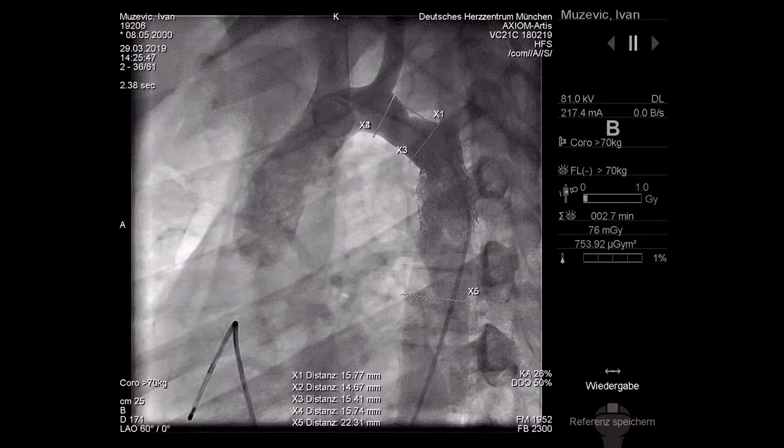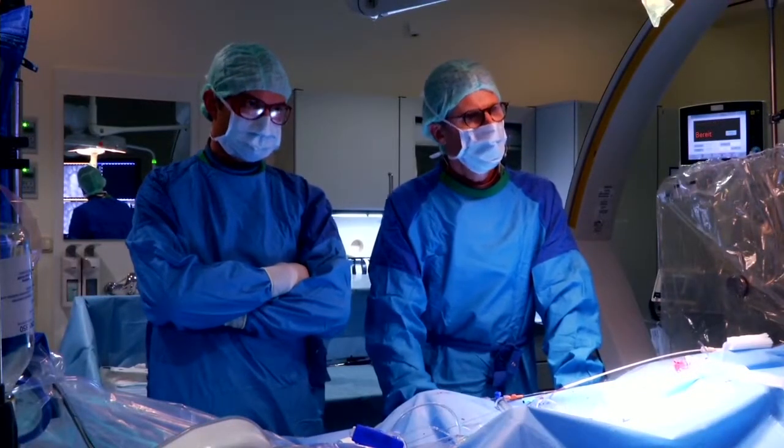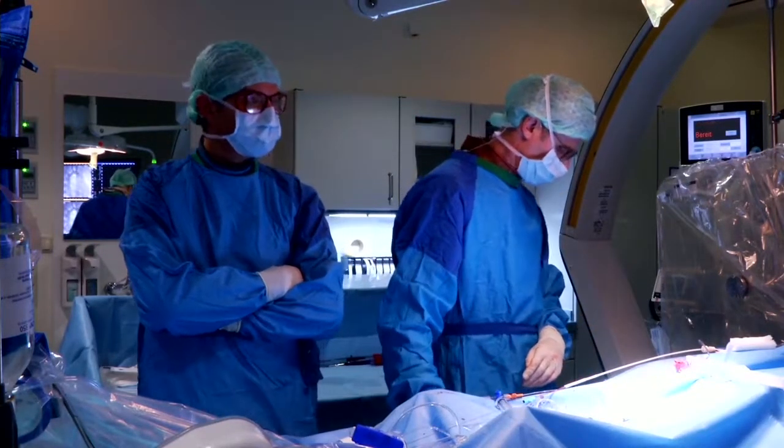Of course, I mean, what is the alternative? That you have surgery in deep cardiac arrest? Or a graft. I think we should try it with a stent at this moment. But we do not intend to overstent the carotid artery. So what is your plan?